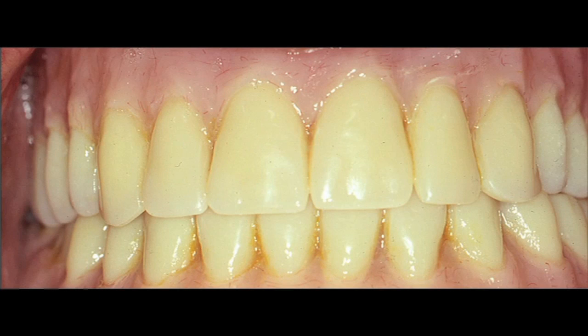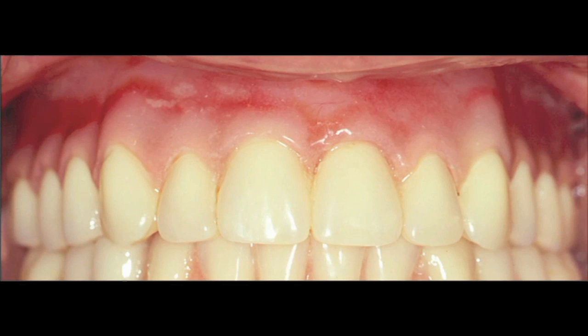So let's recap. Taking a look at her existing denture with an overclosed vertical, teeth set over the ridge, provided her with an older appearance, something that she was not looking for when she had implants. She thought implants would give her a more youthful appearance. With the new denture fabricated, we were able to give her the tooth size and shape she wanted. We were able to bring the maxillary anterior teeth forward from the ridge approximately 15 millimeters by the incisal papilla.